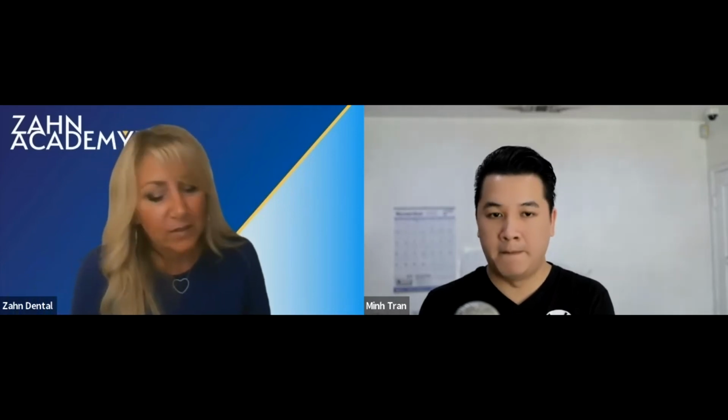Huge advantage. I was going to ask you, what do you feel the biggest advantage is? And that's really the time management and being able to print more than one restoration at a time. So that's fantastic. What do you feel the biggest advantage is with milling? Because we spent a lot of time on 3D printing. What about with milling?